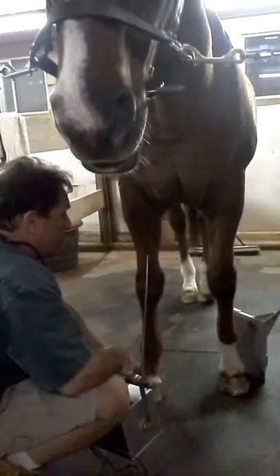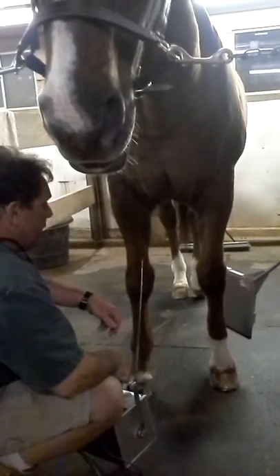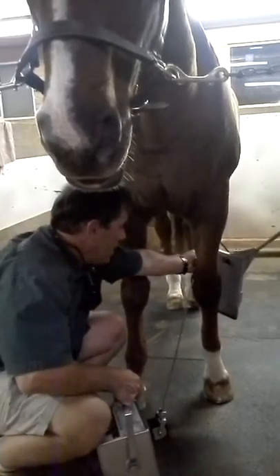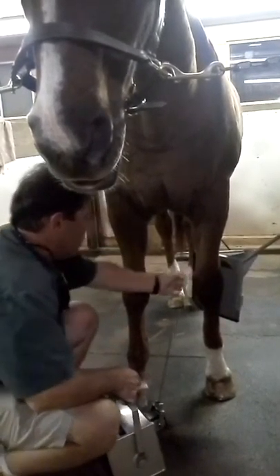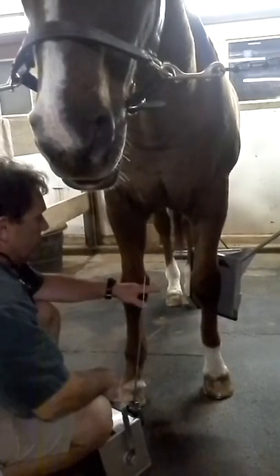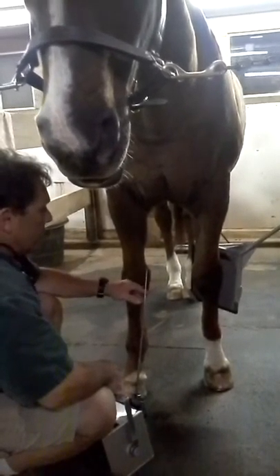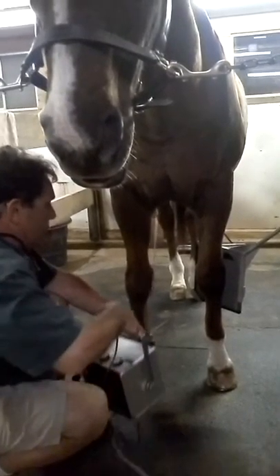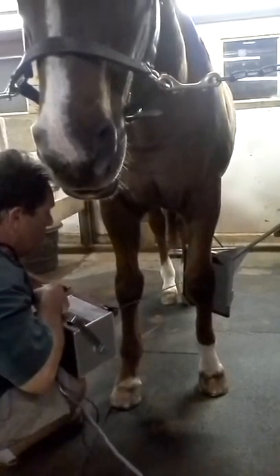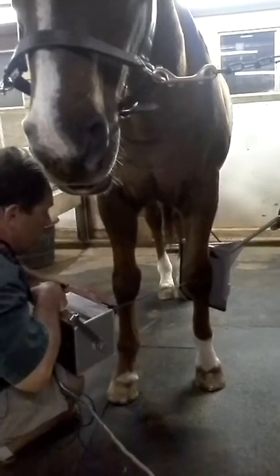The same technique applies if you were taking the knee — you slide it up to the knee. You do the same thing; you just need to come up a little bit higher. The veterinarian or whoever's taking the pictures would position it at the appropriate level to highlight what you're taking. Also, the beam needs to be completely perpendicular to your film so that you don't get an oblique shot.